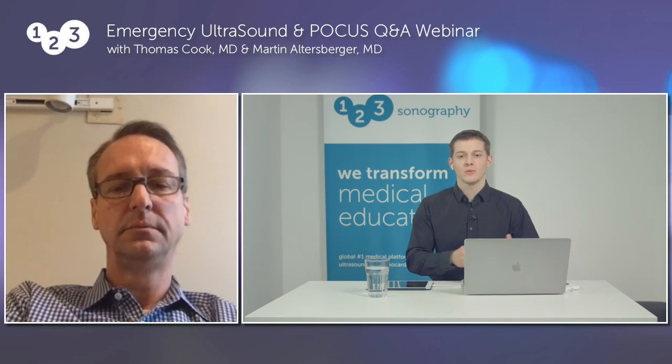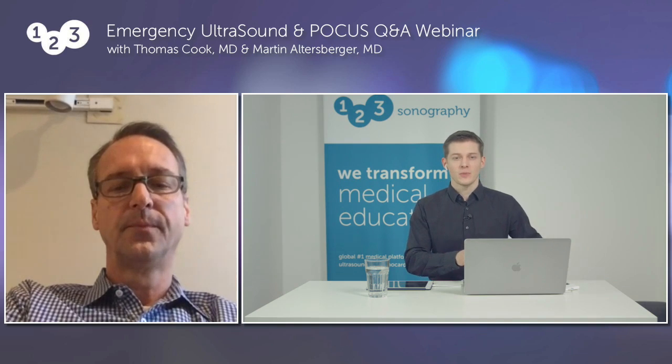I have to interrupt you quickly because Paula was asking a question. I think this fits in perfectly here. Which probe do you preferably use? So when we are talking about lumbar puncture, you already mentioned linear transducer, but also the abdominal transducer, the convex probe for obese patients, which I think is a really great tip.